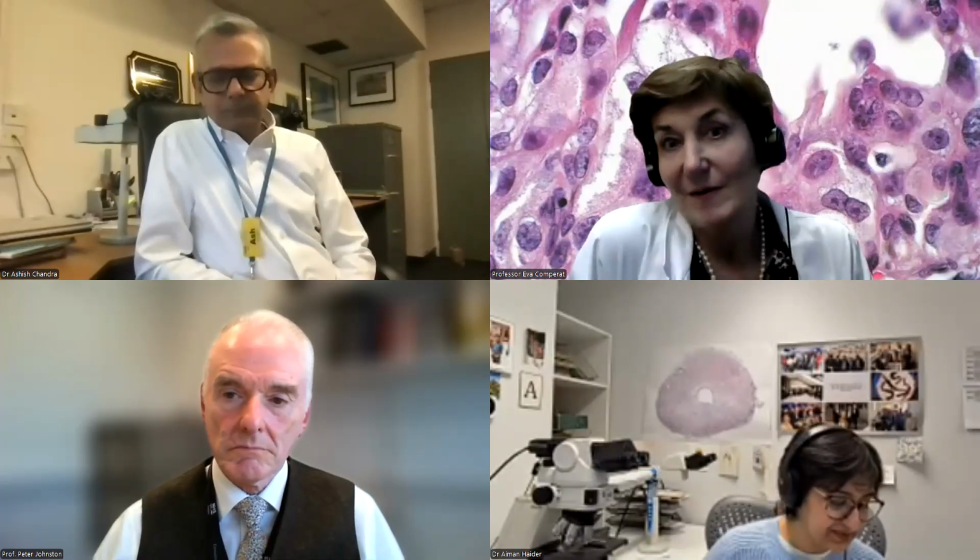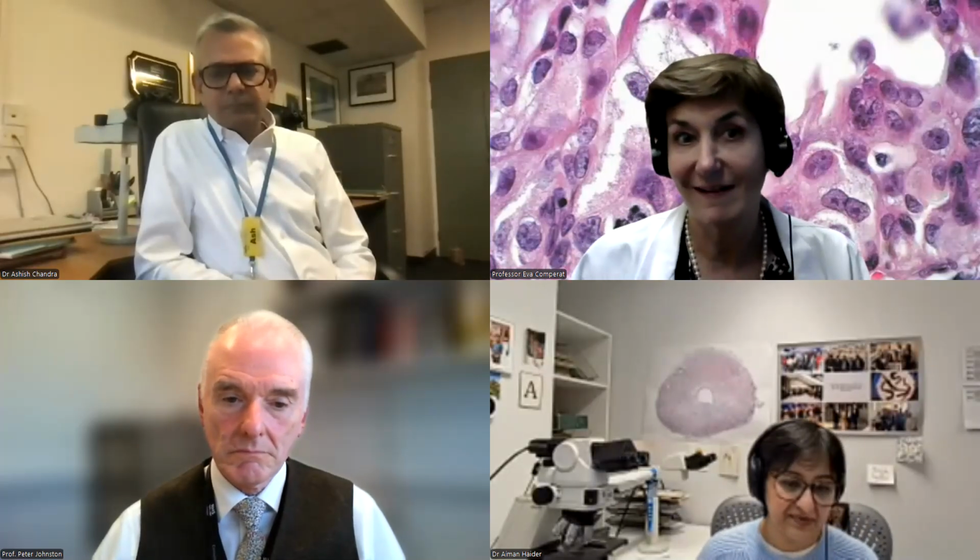I know very many people don't do that. And personally, I don't do it either. But maybe we're wrong. And this is something which is totally unresolved. So basically the idea is to go for the worst bit of the tumor, but where at least the morphology is still well preserved so that the PDL1 scoring can be done. And it's got a good tumor infiltrating lymphocytic infiltrate in the block.